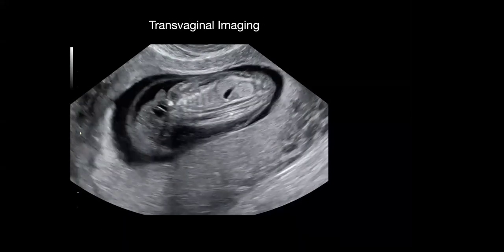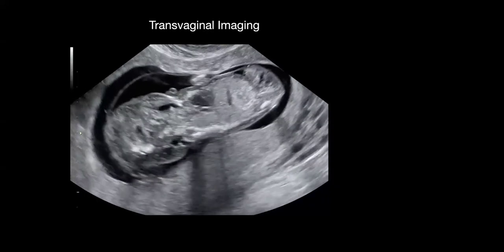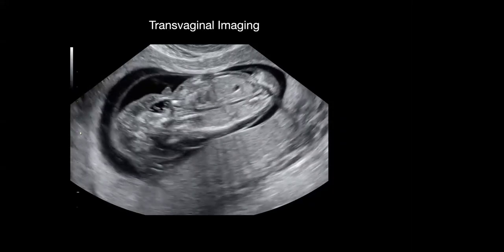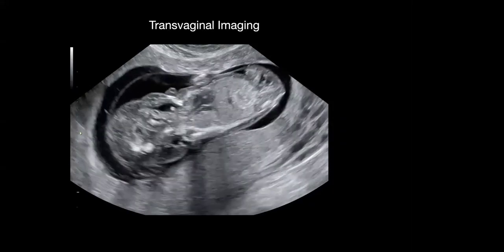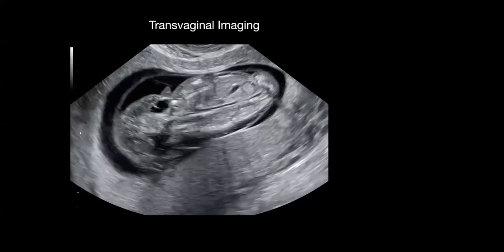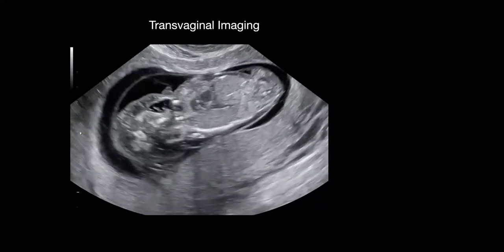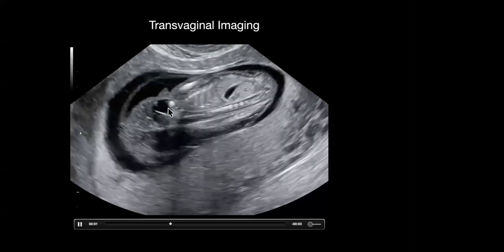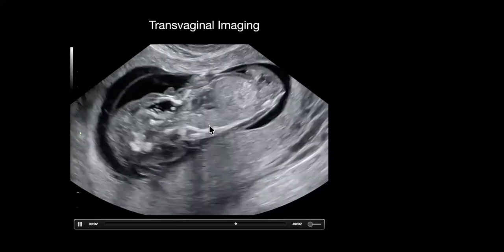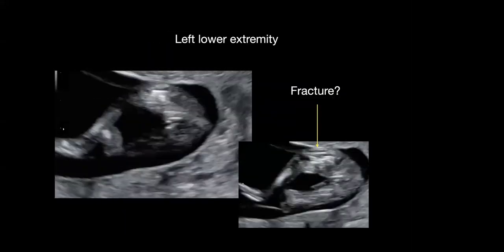And as we're scanning through, looking through structures, many people have asked me if you were to do transvag, can you 100% get the views that you need? I have to admit, with transvaginal imaging, your field of view is limited, and that is the disadvantage. But you can see structures. But how can you optimize this, right? So this is what we were getting. It was really tough, especially with how the fetus was lying. Looking at the neck, this is a coronal view. There's a little bit of thickening around the neck area, but we still moved forward and tried to get other views.